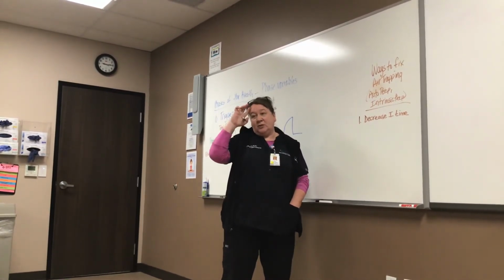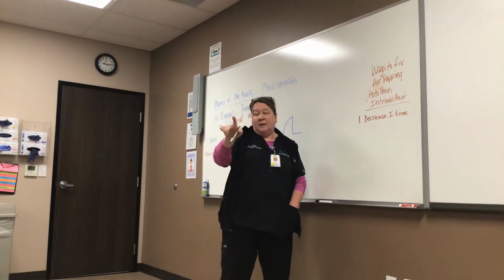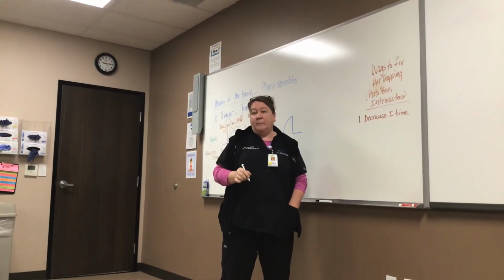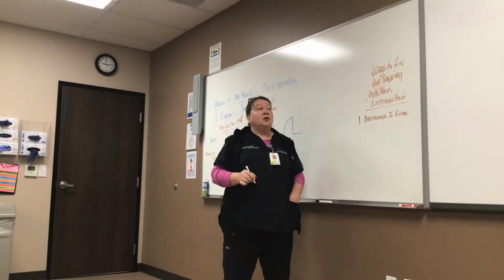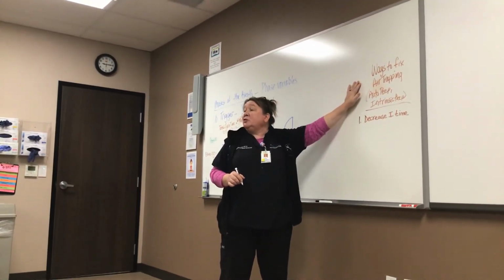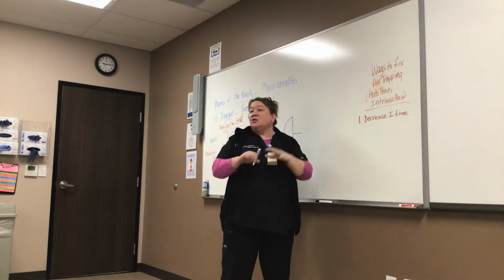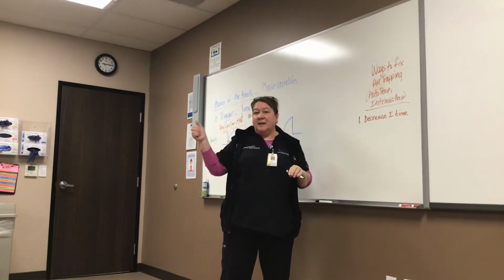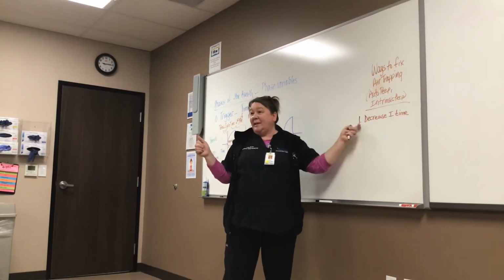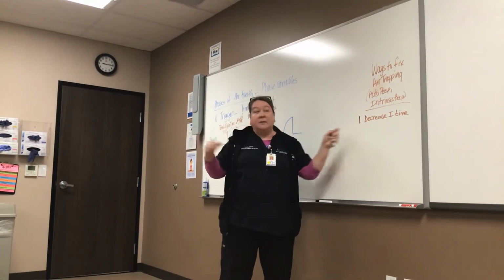That's not an actual answer because you can't go and turn a knob to increase the TCT. So we'll get there in a minute. Sam, would you increase your E time? What you need to know is the ultimate solution to fixing air trapping is to increase your E time. But there's no knob on the ventilator that says E time. So it's not the answer because you can't go to the vent and say increase E time.